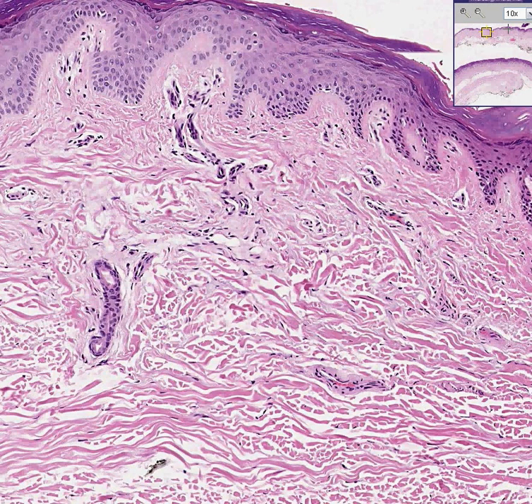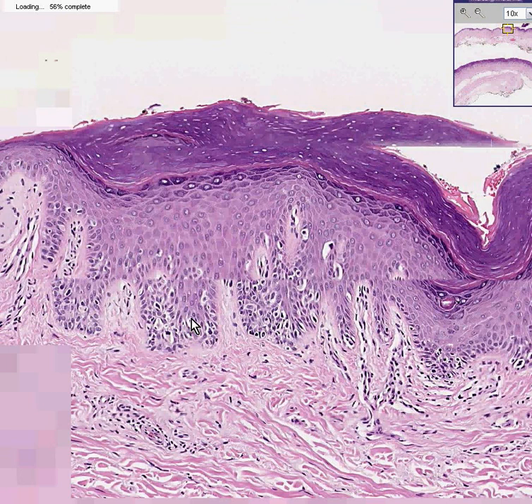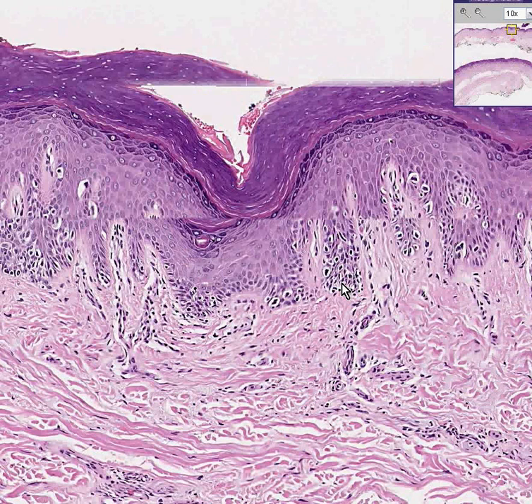If we move down the line a little bit, you will see that these melanocytes are a little bit more numerous. And here, most of these cells are melanocytes. And you're wondering, is this some type of melanocyte proliferation? But what I want to direct to your attention, because it's so critically important, is that it looks like some of these melanocytes, like here, like here, may be moving away from their generally basal situation and going into the mid layers and perhaps even higher of the epidermis. This is called buckshotting because it looks like the epidermis is now buckshot with these melanocytes.